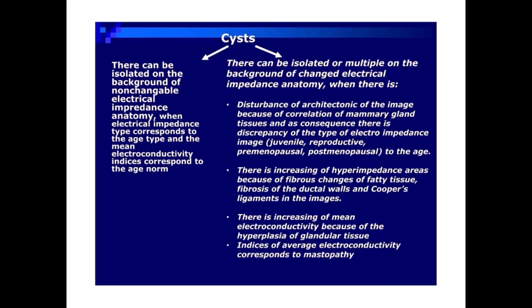Cysts can be isolated or multiple on the background of changed electrical impedance anatomy, when there is disturbance of architectonics of the image because of correlation of mammary gland tissues, and as a consequence there is discrepancy of the type of electroimpedance image, juvenile, reproductive, premenopausal, postmenopausal, to the age.